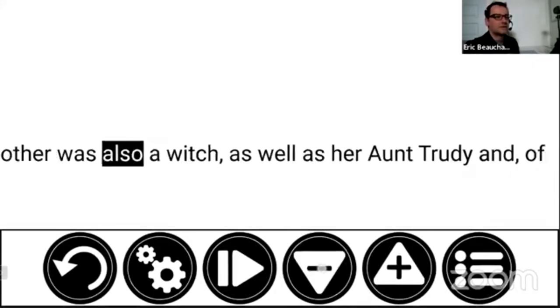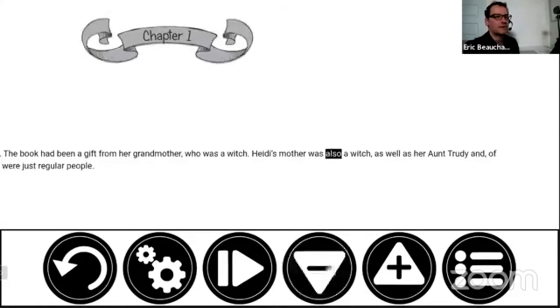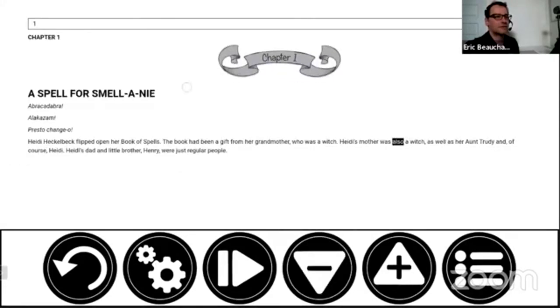The difference between the page mode and the column mode is that the page mode will have, if you zoom out, you'll see the pictures. So that top part is a picture, and you can follow along on the page around the picture. The column mode is there by default. When you zoom in and out without reading, you can see the pictures, but as soon as you start reading, that's why we call it a reading mode, it's going to be in column. So by default, it's going to be a column way of presenting text.